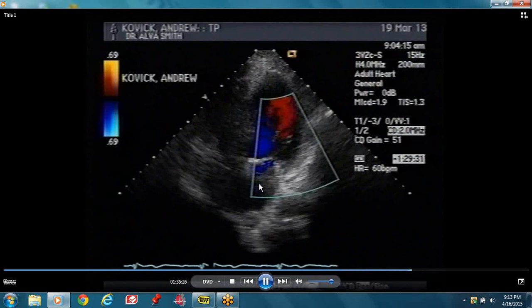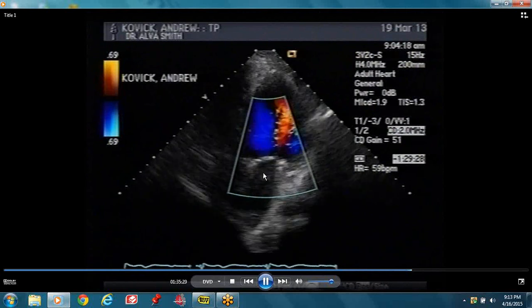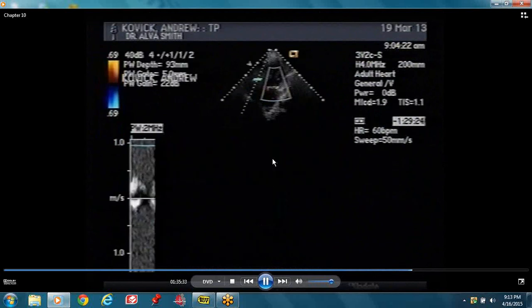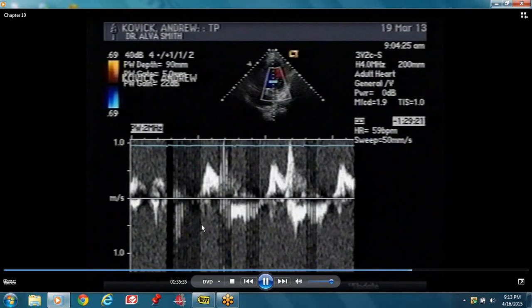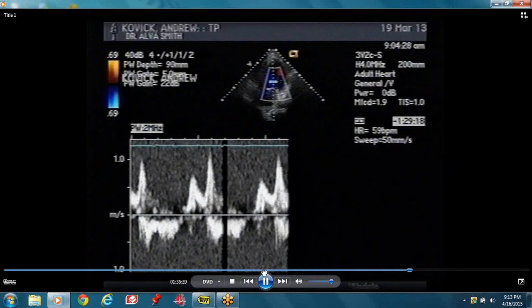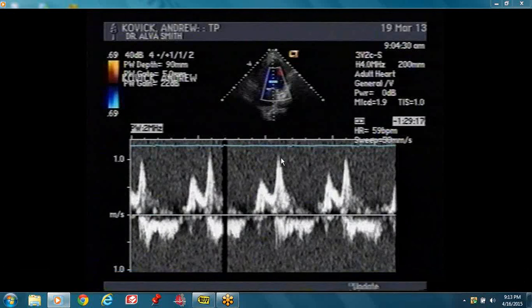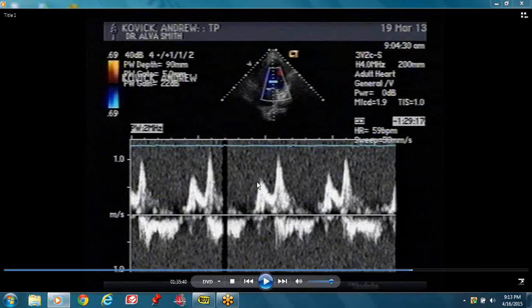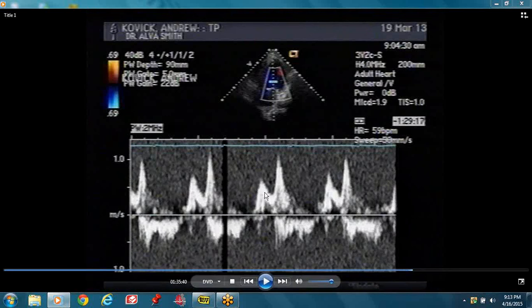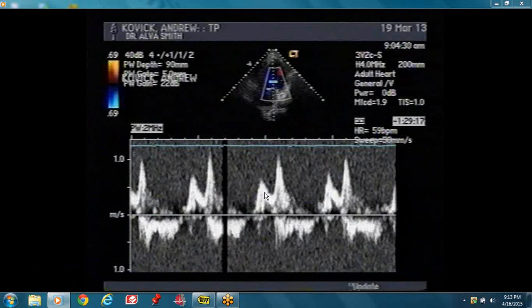The color flow Doppler is across the mitral valve — you have your mitral inflow with your E-velocity and your A-velocity. Your E-velocity is smaller than the A-velocity. This is not a normal patient — either this is as a result of aging, because the older you get you lose your E, or it could be diastolic dysfunction. You have to look at your E-prime.